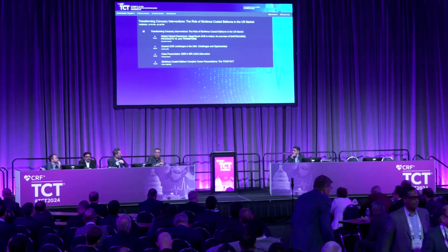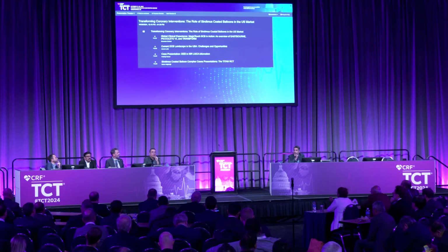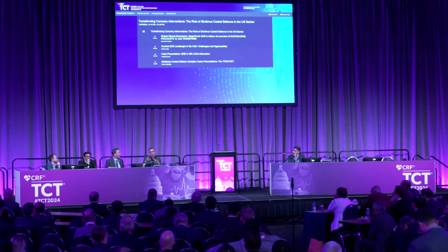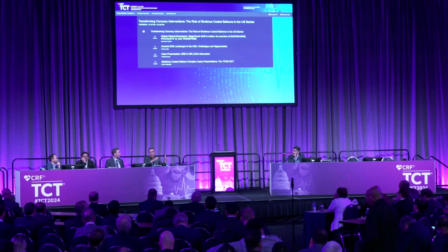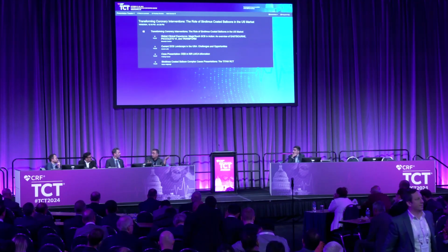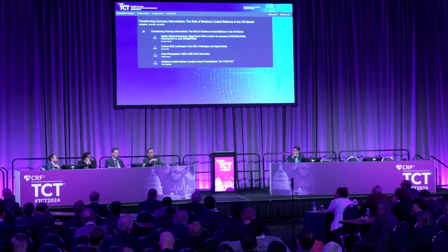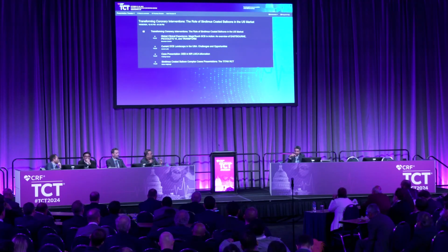No, you're very astute, by the way. I was hoping you were going to miss that. So let me just say, in the Prevail study, they have in one study a randomized arm for ISR against Agent, which I think is probably going to be the way other devices will have to get approved if you want to get ISR, because as Agent becomes more, not readily available, but also reimbursed, I'm not sure. There are also Europeans in this audience. I don't know if you know that in the United States, we pay for an Agent drug-coated balloon, was it $4,500? $6,000. Sorry, $6,000, then comes down to maybe just over $5,000 or something. But the balloon costs $6,000.